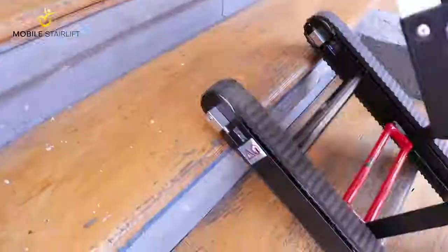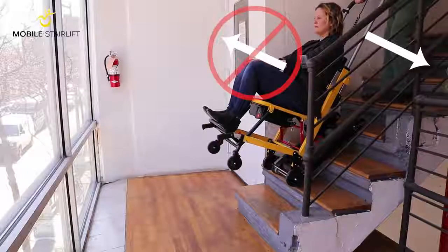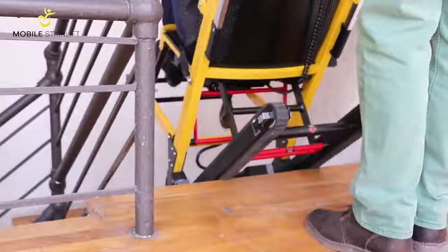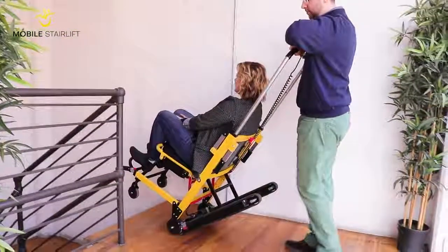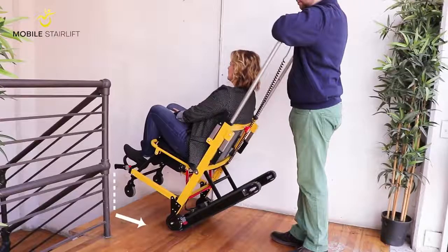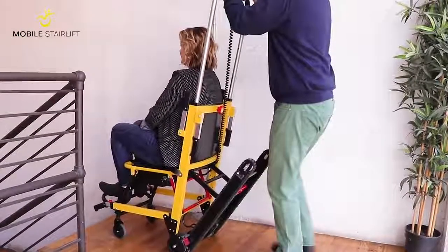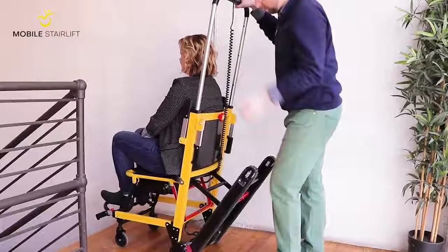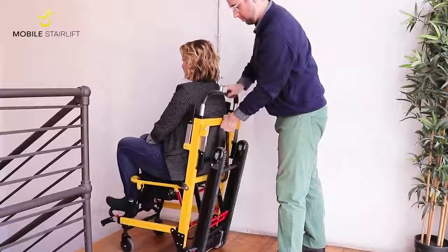Lean the handlebar towards you to tilt the stair lift back until the treads are resting on the stairs. Then press the green button while firmly gripping the handlebar and pulling it towards the stairs. When you reach the top of the stairs, continue moving backward until the front wheels have cleared the edge of the landing. Only then, lean the handlebars forward to return the stair lift to its bottom four wheels. Lock the back wheels, fold the tracks into the upright and locked position, and rotate the red knob to slide the handlebar down.